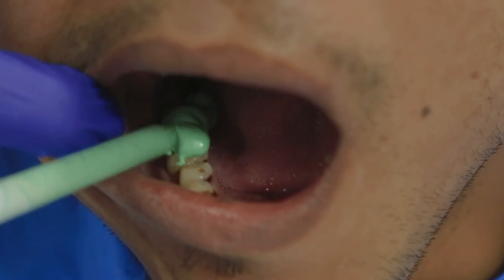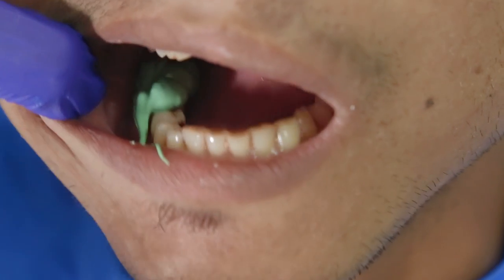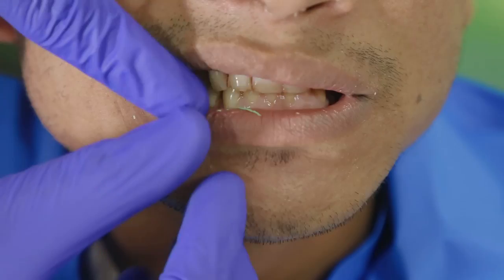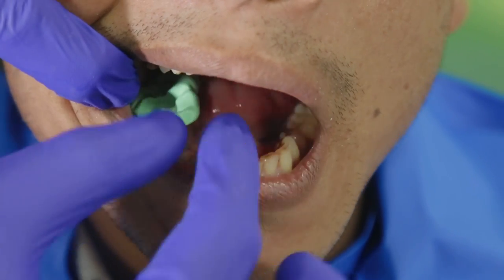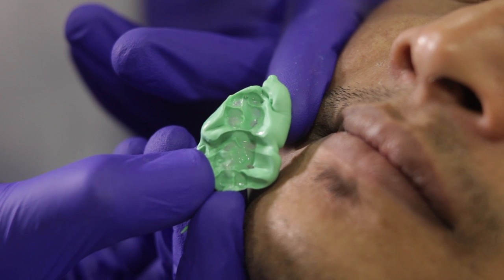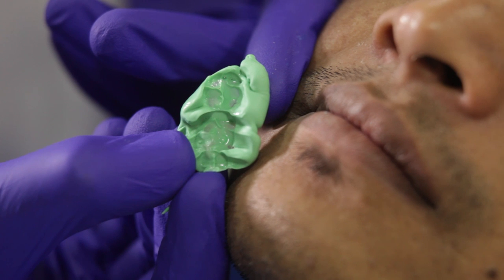Again, I would like to stress that the material needs to be added only over the preps. So assuming that I have prepared the lower 6 and 7, I am placing the material there. After about a minute, I remove it from the patient's mouth — and this is how it looks. Our VPS bite is ready. In my opinion, this is by far the best material to take a bite with, compared to modeling wax or even alu wax.